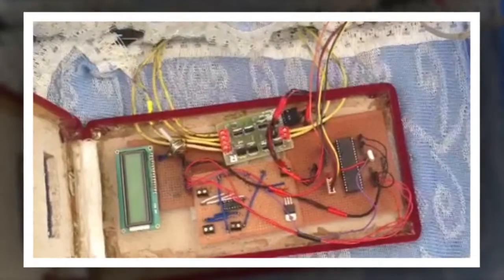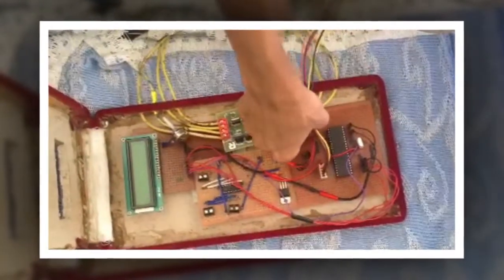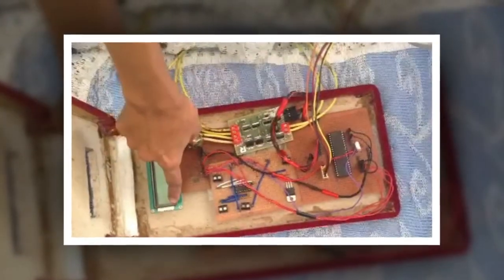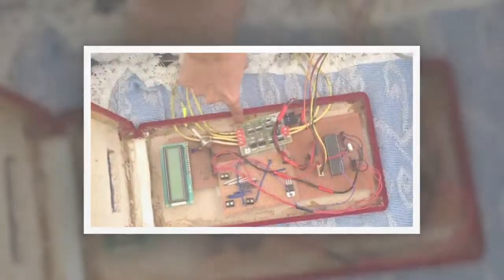This is how we have done the interfacing. This is the Atmega32 which we have used. Port A of the Atmega32 is connected to the accelerometer. Port B and D are used to interface with the LCD. This is the motor driving circuit used to control the left motor and the right motor.